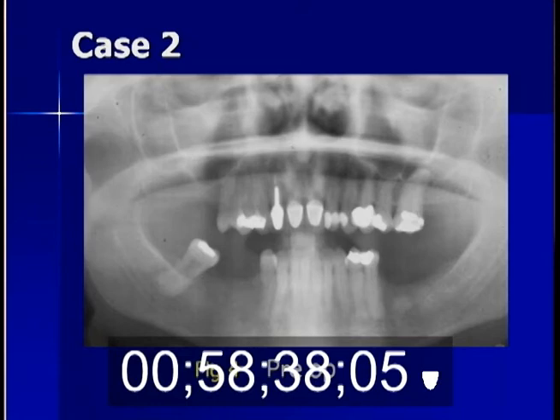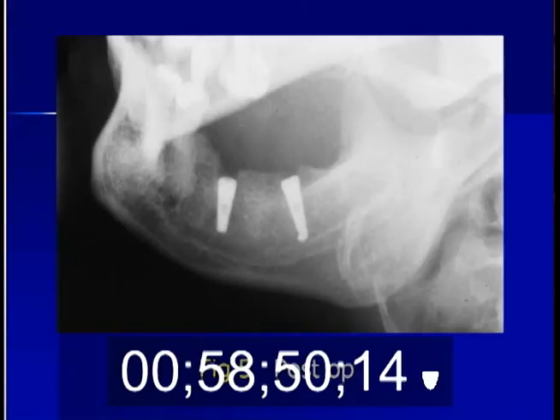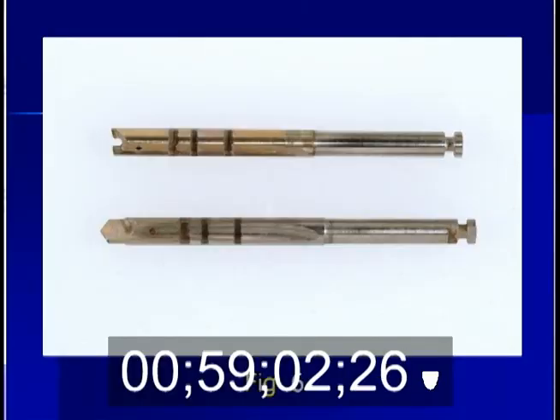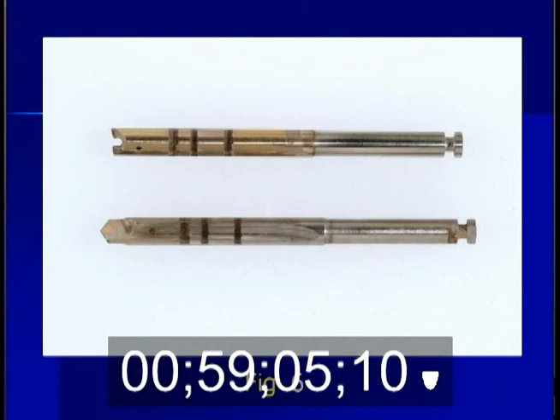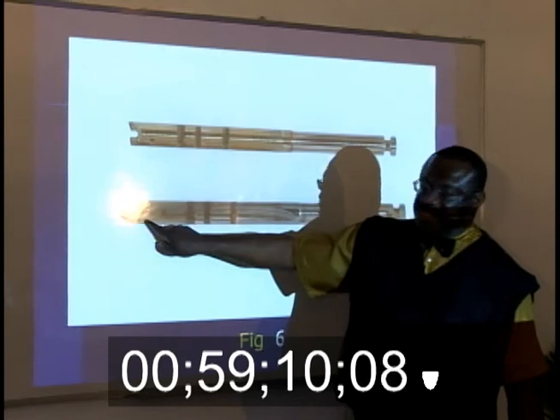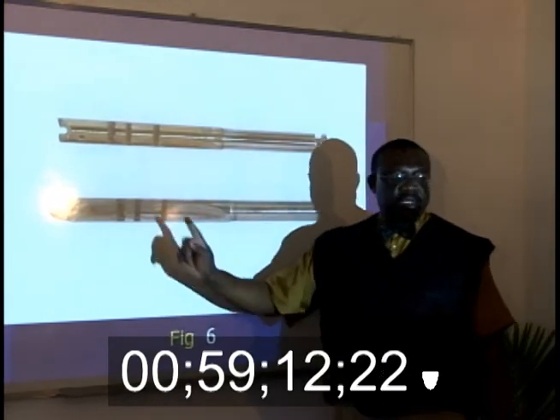And again, I had another patient, and this patient had like a D1 bone in the posterior mandible. Next. And this is what happened. And the fracture was very close to the inferior dental canal. I just left it there. Okay? Now look at the pilot drill. See right here? This is a big chunk that will fracture. This is a little piece that will also fracture. Okay? Next.